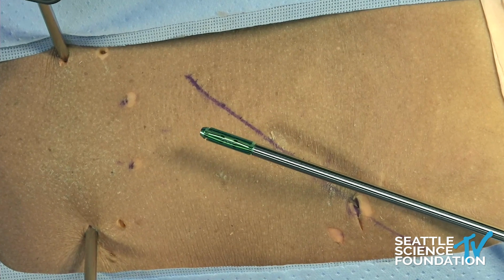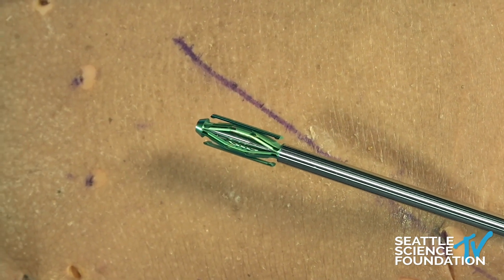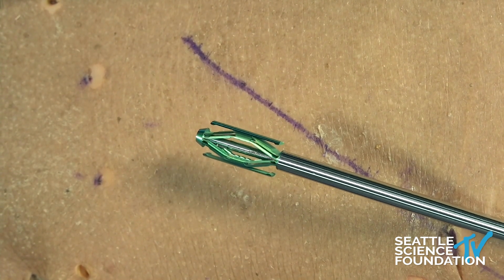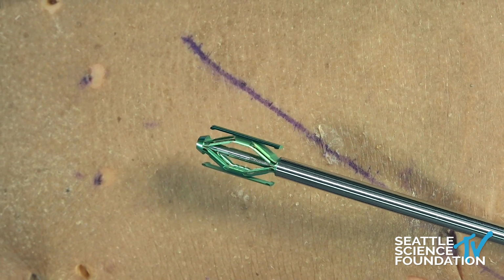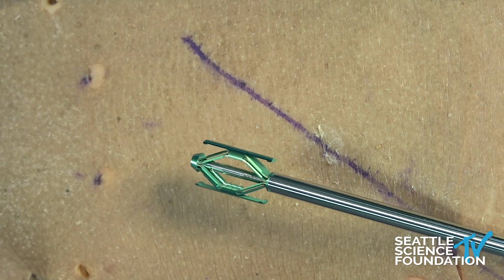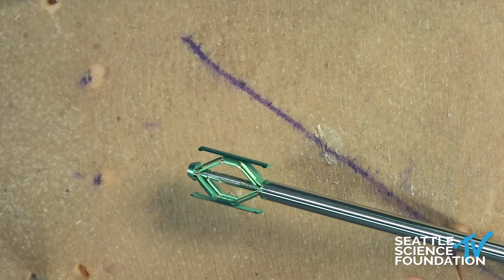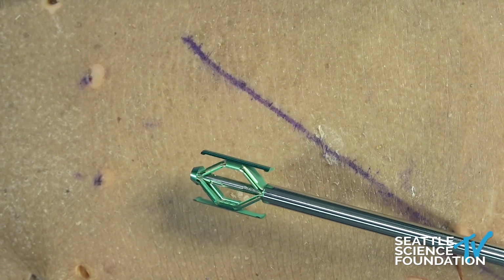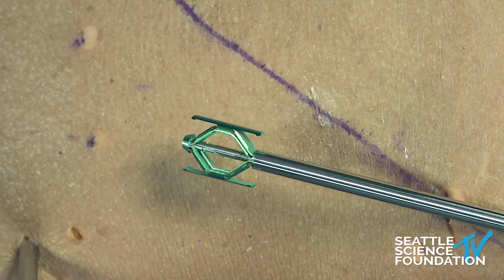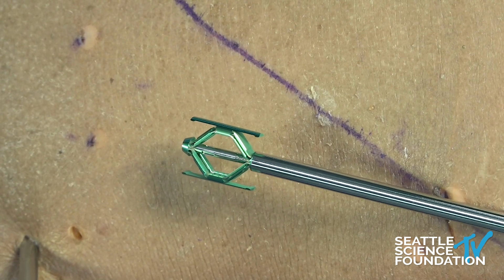So what we have here is the spine jack 5/8 as it's being deployed. As I'm turning the butterfly handle, this thing's coming up. And it's kind of like a molly bolt configuration. It's going from proximal to distal and is pulling this together. And as Neil mentioned, this is a scissor jack type of scenario of lifting force. This has 1,000 newtons of lifting force. Also, as this deploys, it's made out of one piece of laser cut titanium alloy.